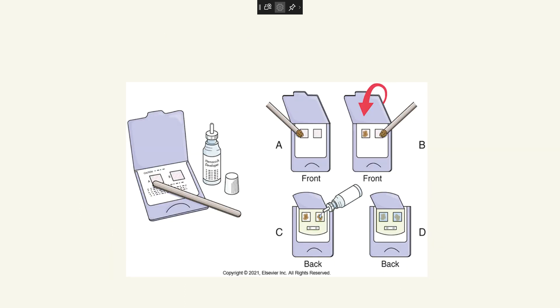When testing for occult blood, the stool is smeared in box A, and then more stool is smeared on box B, and then the flap is closed. You then apply a developer to boxes A and B on the back side of the test packet, and the color changes are noted.